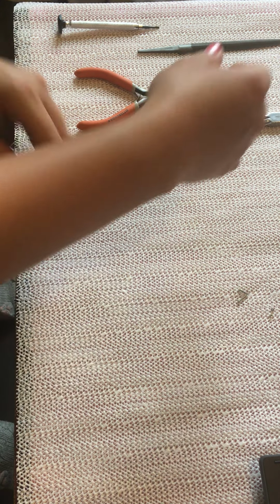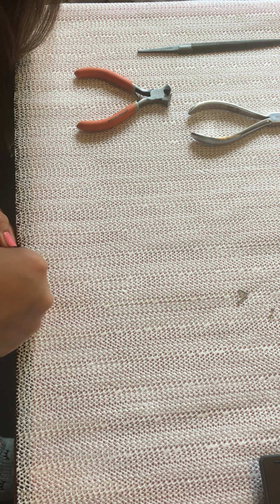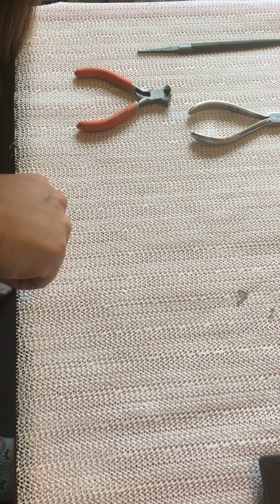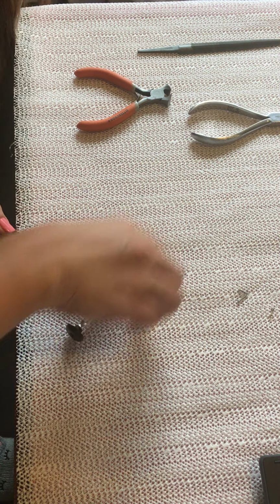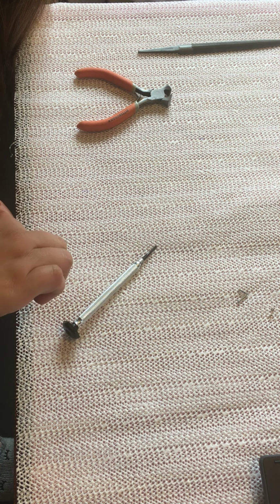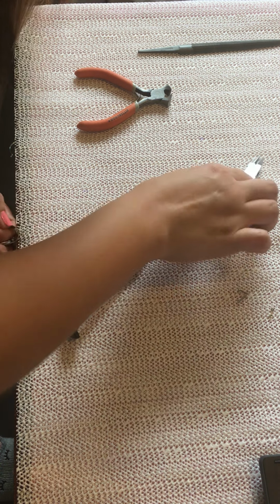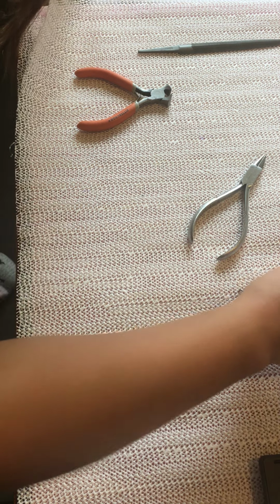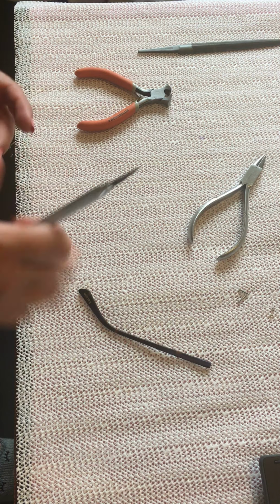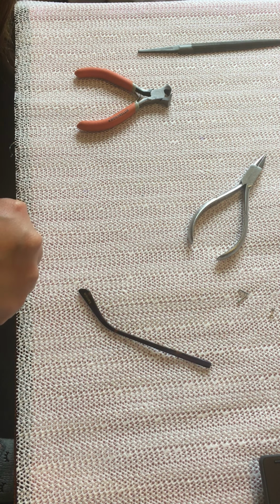Okay, so the first thing I'm gonna do is use my flathead screwdriver and remove the existing screws on this frame. So I will remove them. Okay, one is out. Now I will remove the other screw.